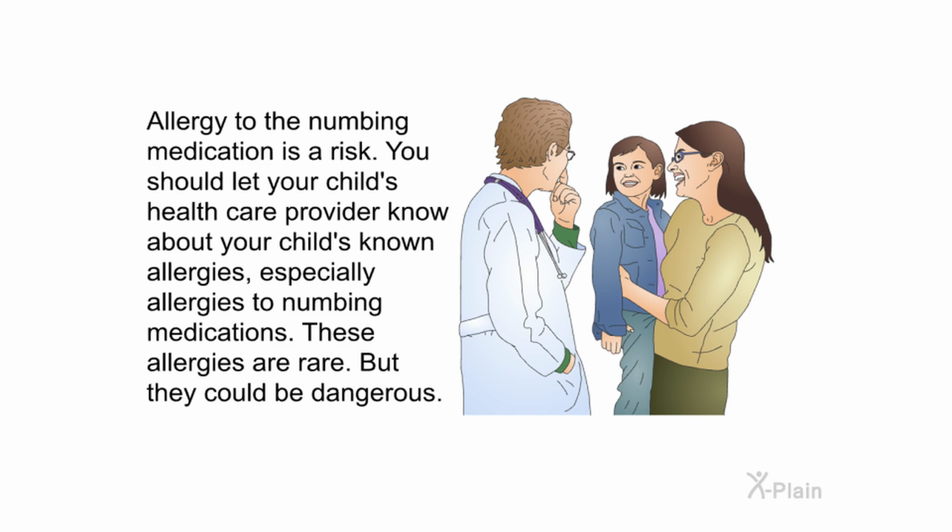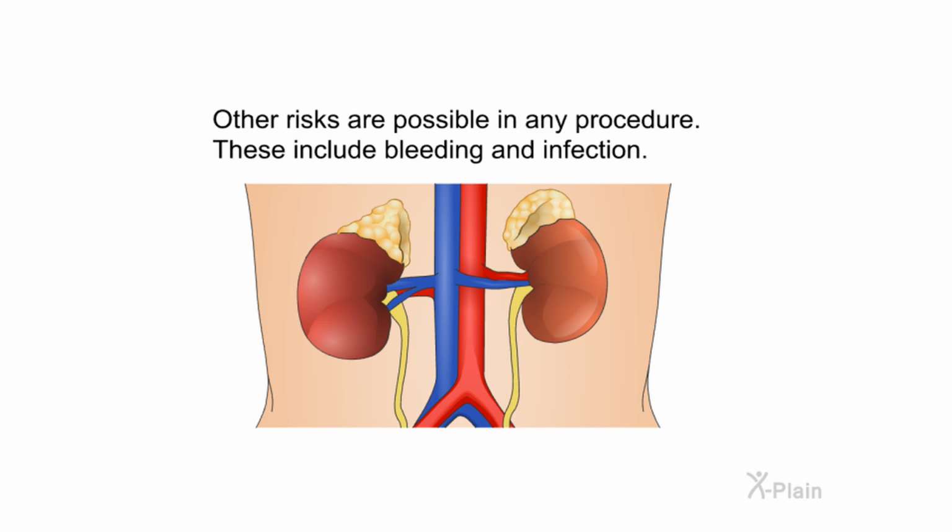Allergy to the numbing medication is a risk. You should let your child's healthcare provider know about your child's known allergies, especially allergies to numbing medications. These allergies are rare, but they could be dangerous. Other risks are possible in any procedure. These include bleeding and infection.